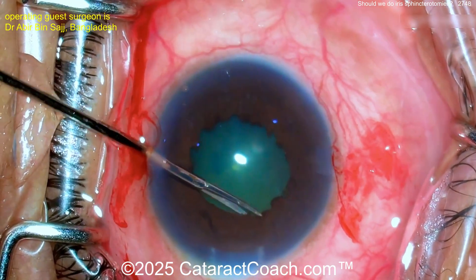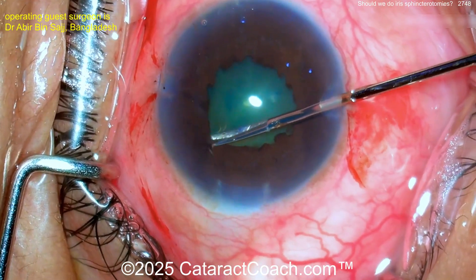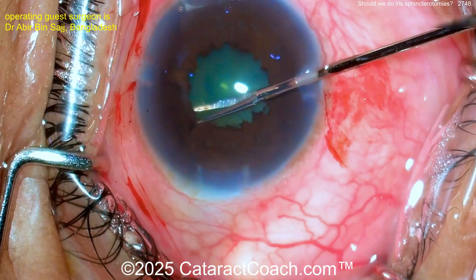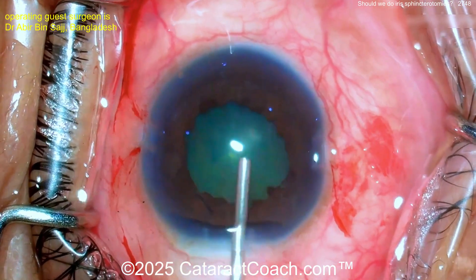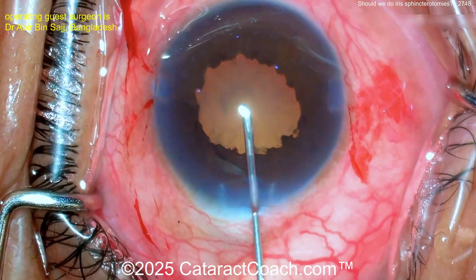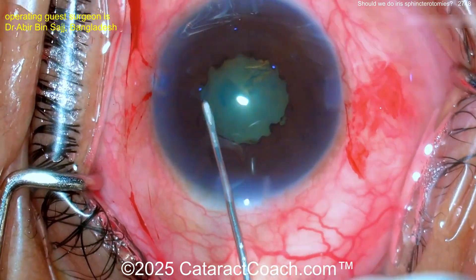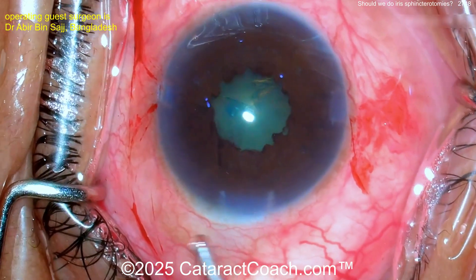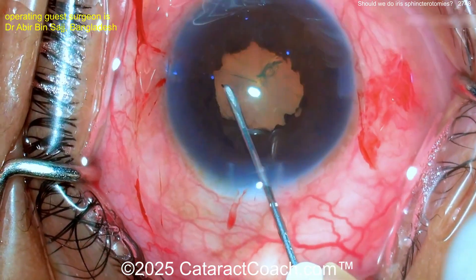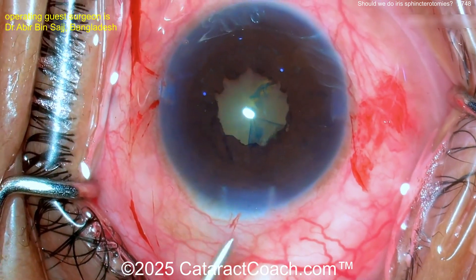If the patient is concerned with cosmesis or cosmetic appearance — certainly if you have a patient who's an actor or actress and will be on camera, especially with light-colored irises — I'm not sure I'd want to do this. Because as you can see, it definitely works and definitely expands the pupil, but now you've got an irregular pupil margin that's permanent. There's no undoing this. But if the patient really isn't concerned about it, then it's a reasonable technique, and it may actually prevent future miosis or pupil contraction.